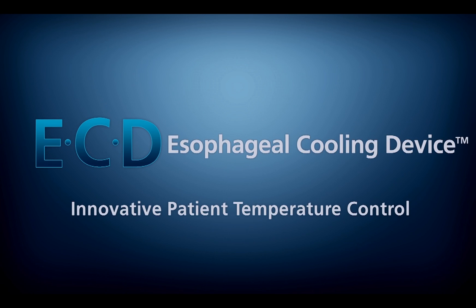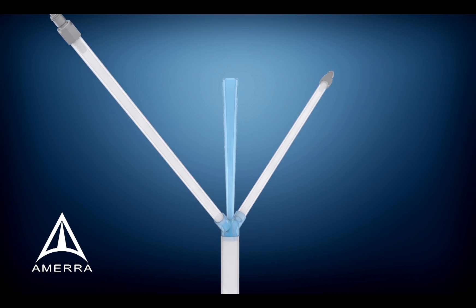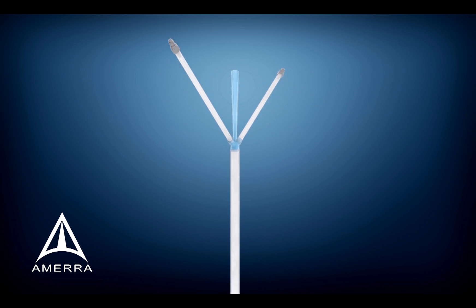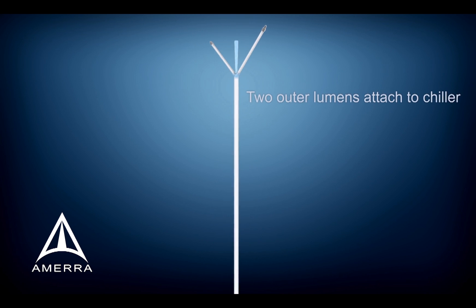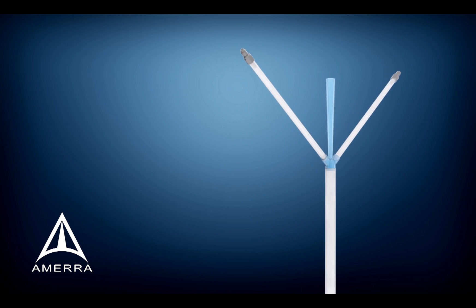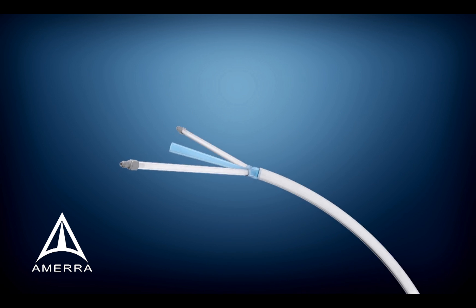The esophageal cooling device, or ECD, by Advanced Cooling Therapy is a revolutionary new medical device to control and modulate patient temperature. The ECD is made of medical grade silicone and incorporates a fully enclosed coolant flow system where two outer lumens are attached to commercially available chiller machines, and an independent central lumen connects to wall suction to replace the standard nasogastric or orogastric tube.